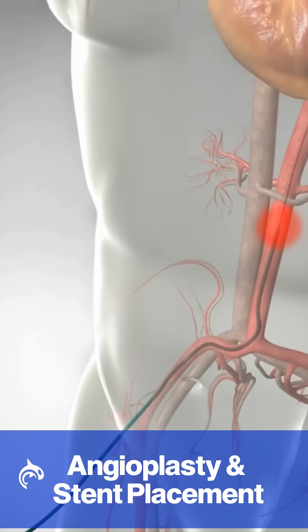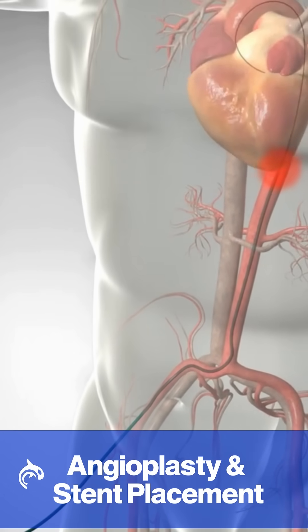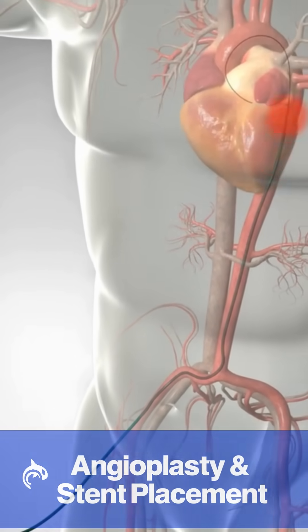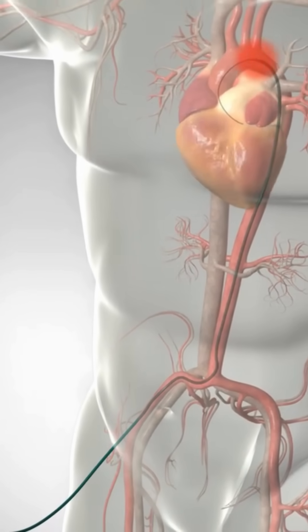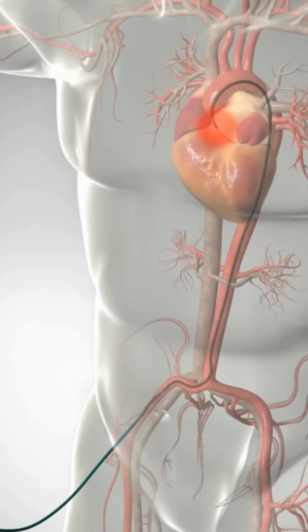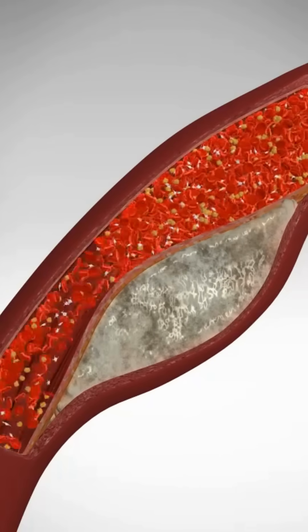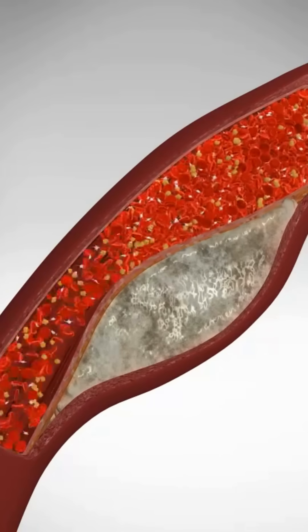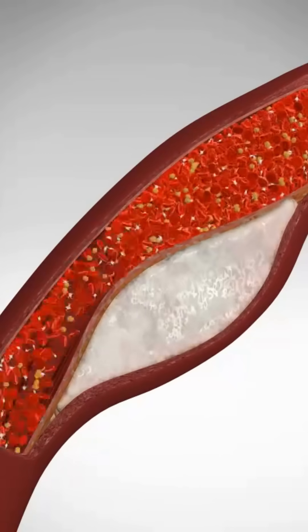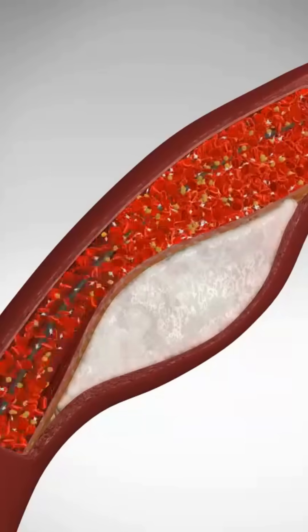An angioplasty and stent placement opens blocked arteries. The procedure requires a cardiac catheterization. Now we're inside a heart artery. Here's the plaque that's blocking the flow of blood.